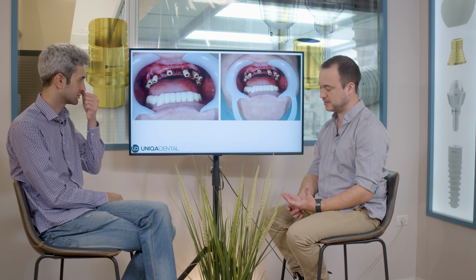You have a lot of small problems, but the main reason why we want to change those bridges, extract the teeth and do implants is not the aesthetics, it is the caries and the teeth under those bridges. Because her relations are quite correct and the vertical dimension of the occlusion is fine, we want to change the bridges one by one. We don't want to do everything from the start.